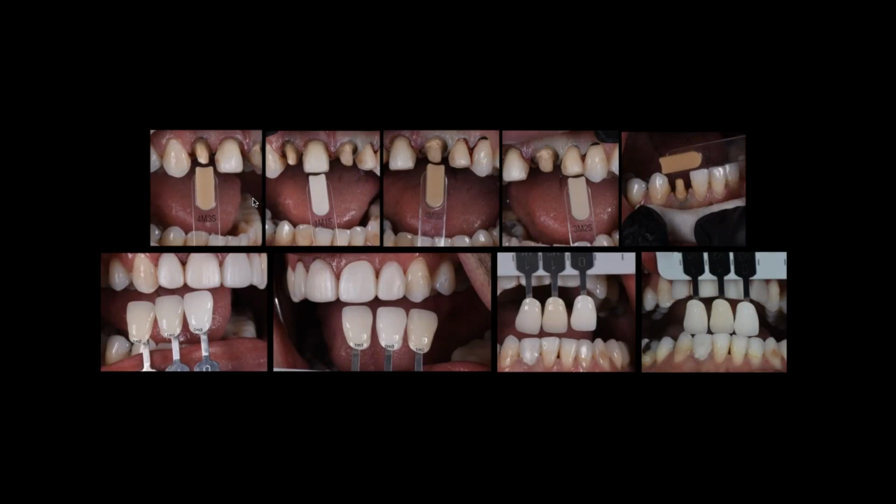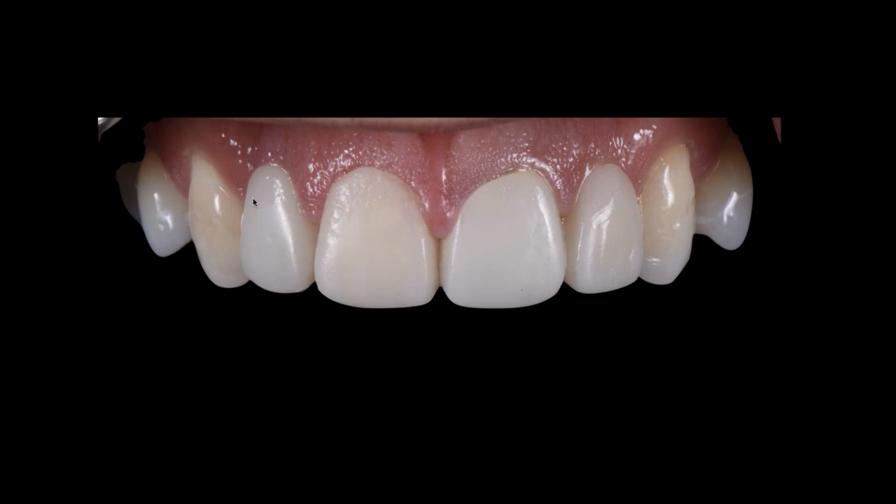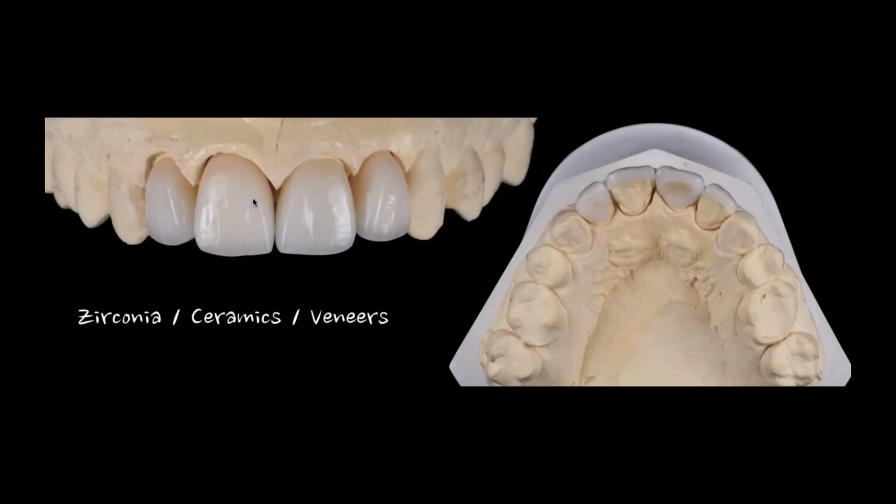And this is why I think it's so challenging today, because although I don't want to say the first case was easy, it wasn't. It was a full mouth, it was a difficult case, but the spacing in the end was the same. It was basically a full mouth of prepared teeth, and it allows me to do the most I can with any material that I choose. On a case like this, where I have to really match the rest of the mouth, it becomes more challenging. And also I have a lot of different spaces to work with. And your ability to understand this opacity here is going to be even more critical for us to make this case a success. So we'll provisionalize the patient. I wound up doing 5 restorations. I did a single unit on the lower, which I'll show you in a second.